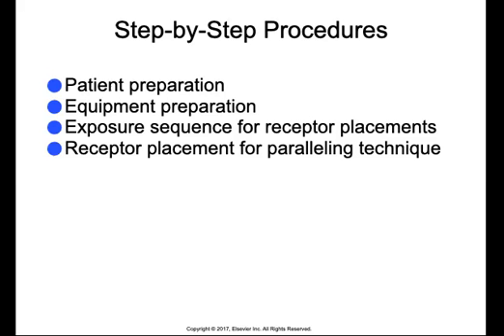Typically, when you're doing paralleling techniques, you'll start with the anteriors, and you'll start the same way that you read, from left to right. We'll start from the top, then work our way to the bottom, and then go on to the posterior section, also from the patient's right or your left. You'll start from the upper right quadrant, go on to your lower left quadrant, and then from there switch to your upper left quadrant and then your lower right quadrant.